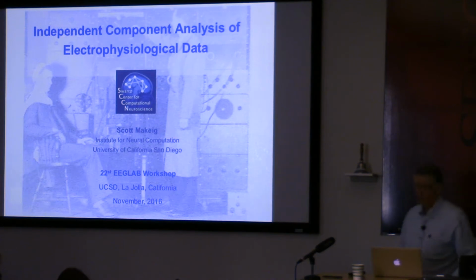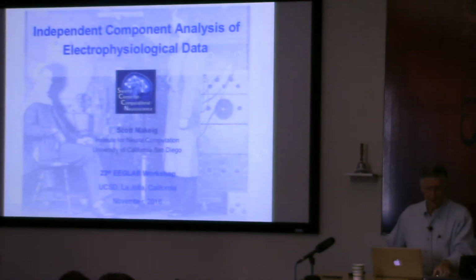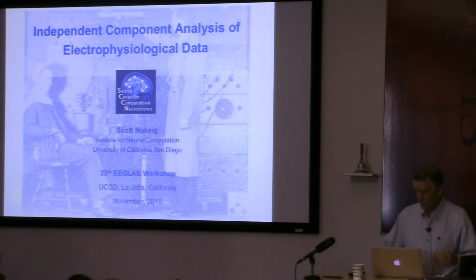So we're going to continue about ICA, which I think is a fundamental tool nowadays for moving from recordings, study of fuzzy scalp patterns, highly fuzzy scalp patterns, to much better defined dynamics and imaging of source-resolved EEG data.